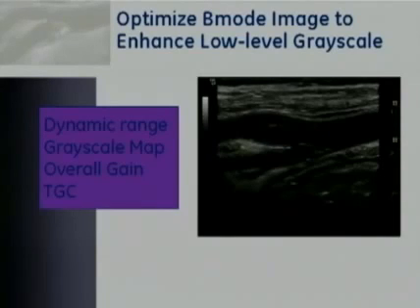One of the most common mistakes I see with new sonographers performing vascular exams is that they oftentimes want to make the image a very high contrast, and even sometimes take the TGC, time gain compensation, and decrease it across the vessel so that the inside of the vessel is really black, thinking that that's the best image they can make. But what you realize over time is that by doing that, you've really erased some real information and have decreased the likelihood of having the ability to display low-level grayscale or hypoechoic plaque, which can be very important plaque to display.